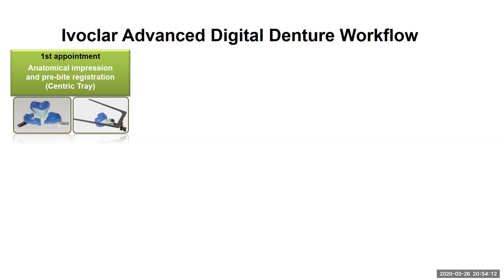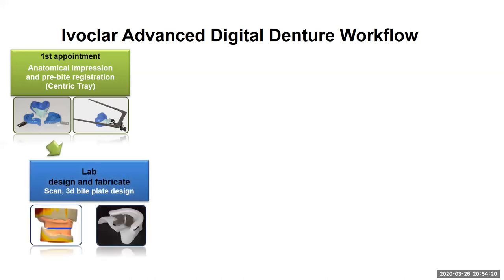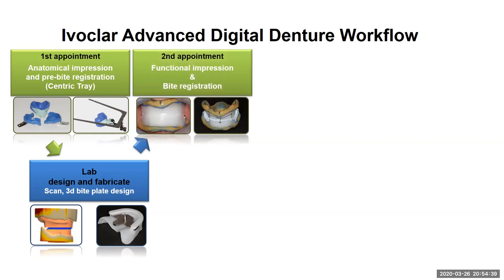And with this centric tray, you're also utilizing something called a UTS CAD. This is going to give us our occlusal plane and bipupillary line. So you send that information to us at the laboratory, and we can scan it, and we can print a 3D bite plate design. So instead of having that bite occlusal rim, we're going to print a 3D bite plate design. And then you have the option of using a Gothic arch tracer and taking a bite registration. Second appointment, they'll take a functional impression inside that 3D bite plate, and you'll take a bite registration. You can utilize a traditional bite registration method, or you can utilize the intraoral tracing device.